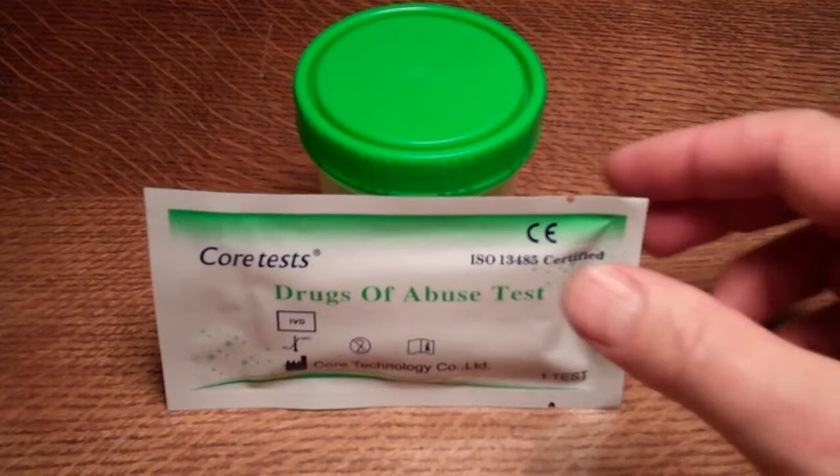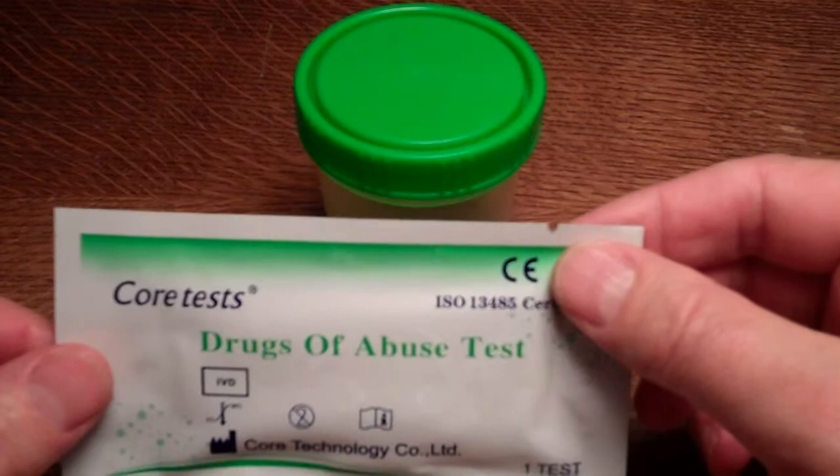The sensitivity of the Core Test brand, as in all European sold cannabis drug tests for urine, is 50 nanograms per ml.